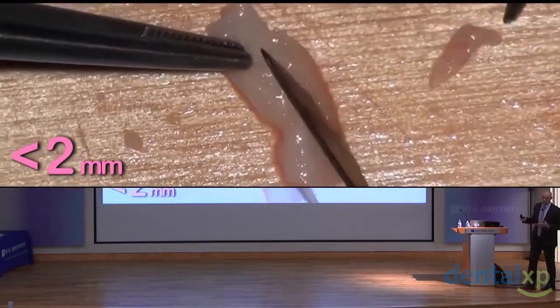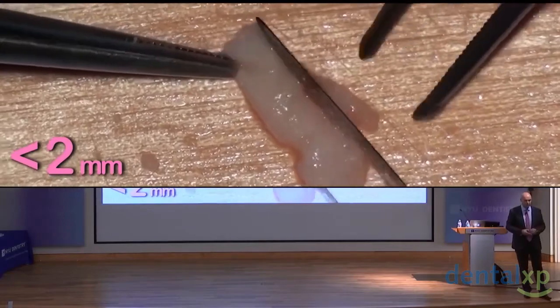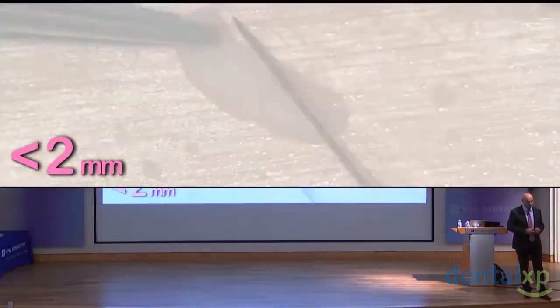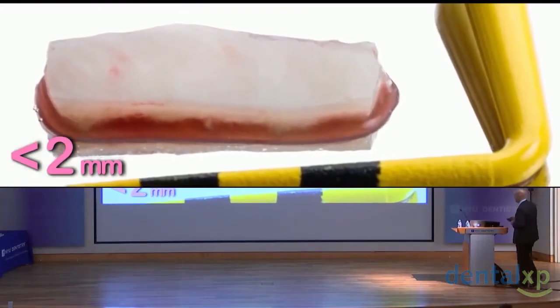Sometimes I had problems de-epithelializing the soft tissue, so I observed that some epithelium is into the graft and causes problems. But okay, it's another possibility.